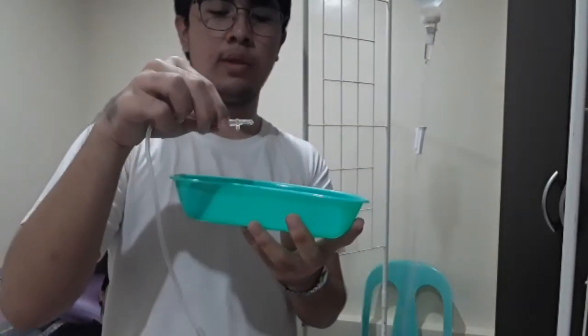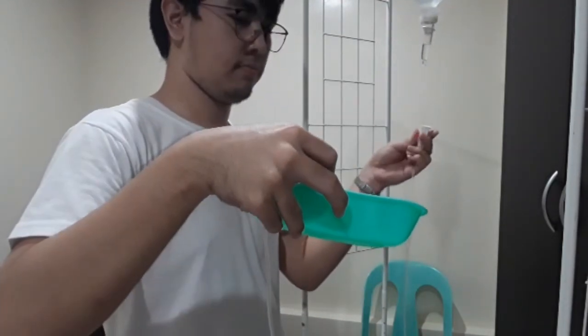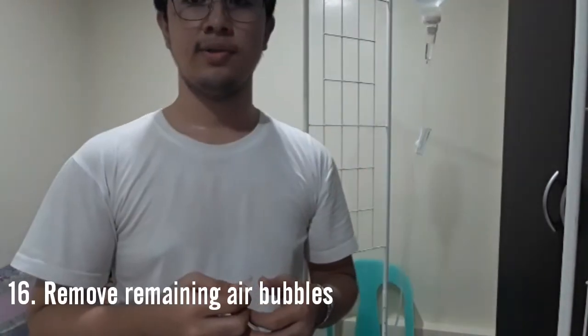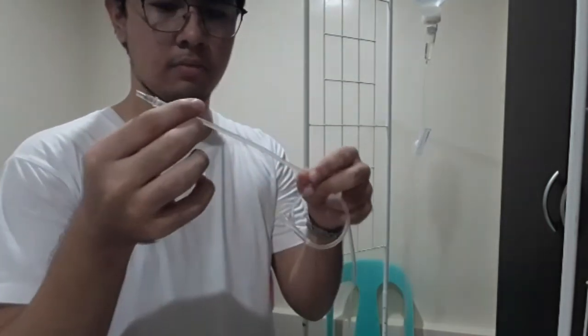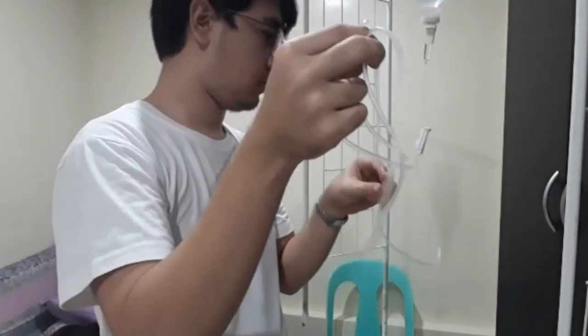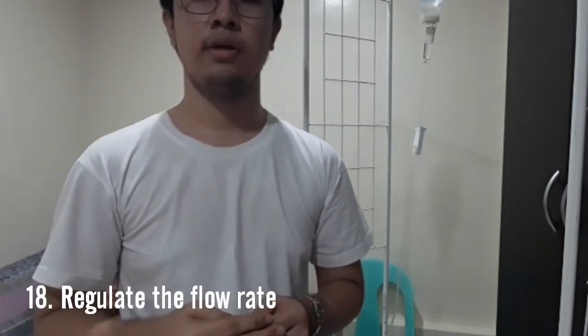Once fully primed, we will now close the clamp. So after closing the clamp, we will now check for bubbles, and if there are bubbles, we will try to eliminate them. Okay, so there are no bubbles in the tube. We're gonna attach the luer lock to the IV catheter, and afterwards we're gonna regulate the fluid according to the doctor's order, which is 20 drops per minute.